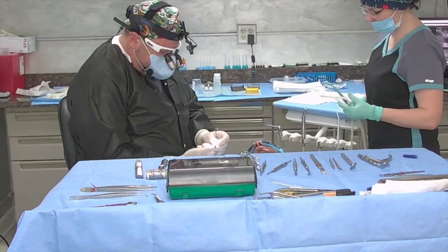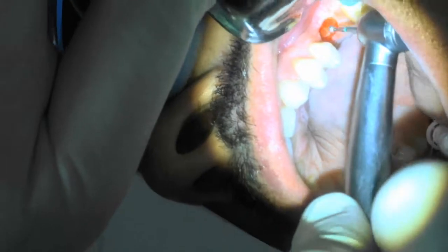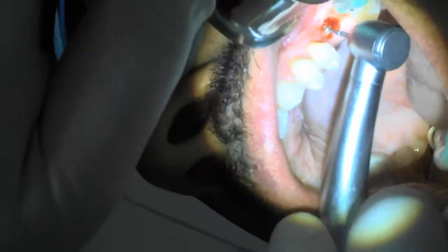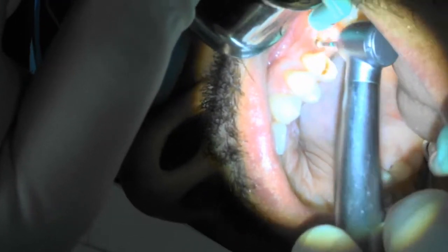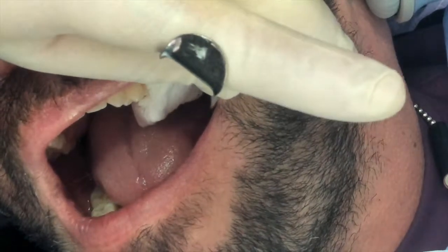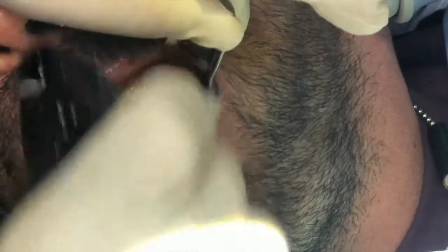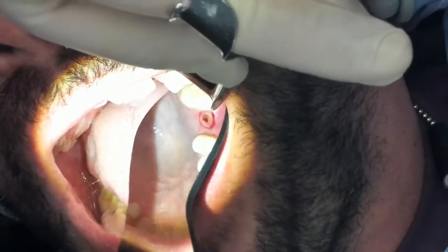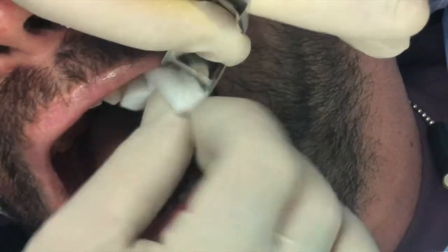That measurement again that I have is how much? 8. Okay, great. So we've got 8.5 millimeters, floor to septum of the sinus. So I'm going to go back to a smaller round diamond, towards me. Starting my osteotomy site, just so I can control my drill now when I go to my corner. You could see that the site has started, right where we're going to be with our implant.